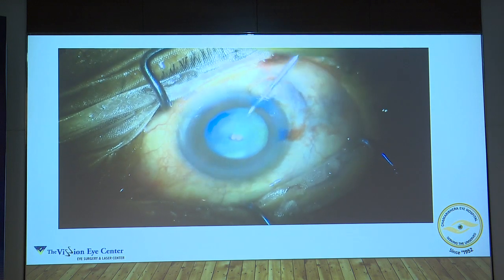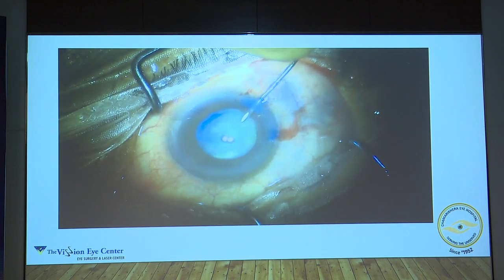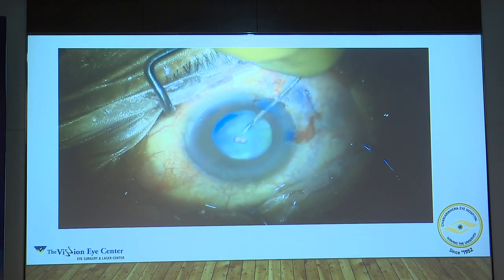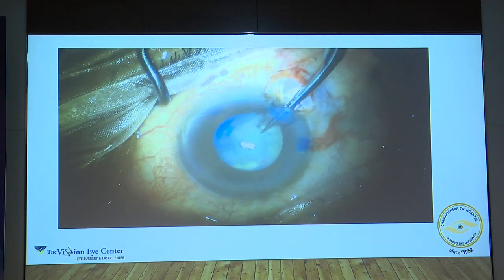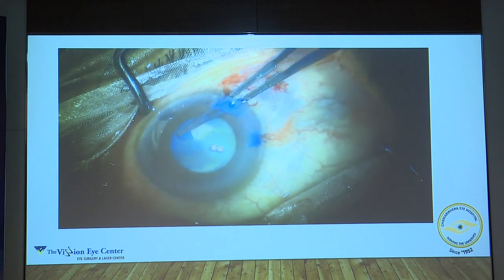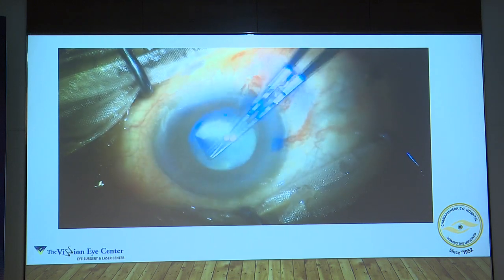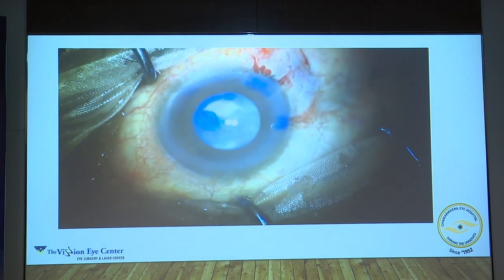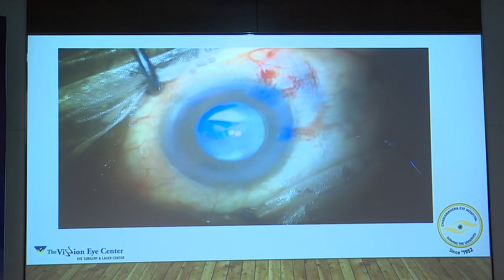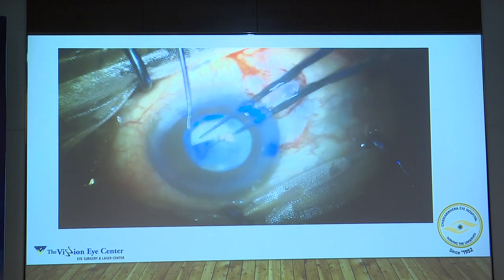This is another case which is intumescent. You first go in and try to reduce the amount of pressure inside the lens. Once that is done, you will see that once the rhexis is made, there is a brown cataract underneath. In younger people, when you get these white cataracts, they are generally softer. But in older people, when you get these white cataracts, underneath the rhexis is lying a hard brown cataract. Because this is an intumescent cataract, it is very easy for the rhexis to run out — so always be careful and make sure your chamber is stable.